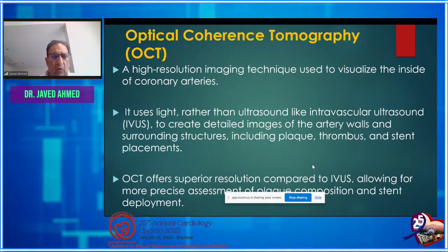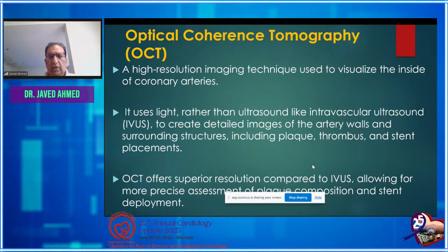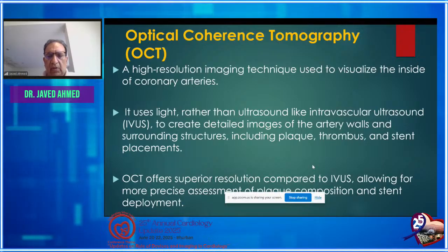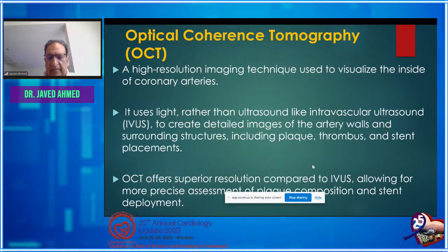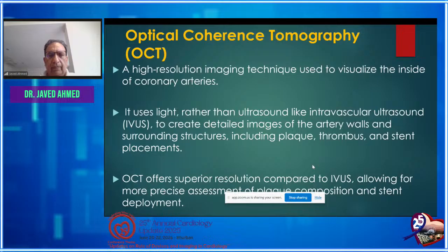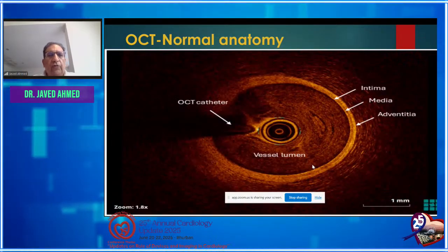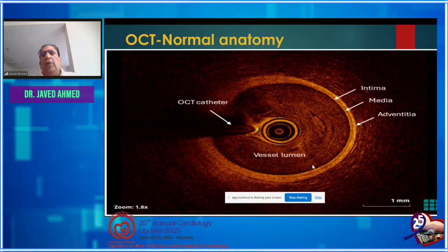OCT or OFDI also offers superior resolution compared to IVUS, allowing for more precise assessment of plaque composition and stent deployment. And this is an image of a normal coronary anatomy.